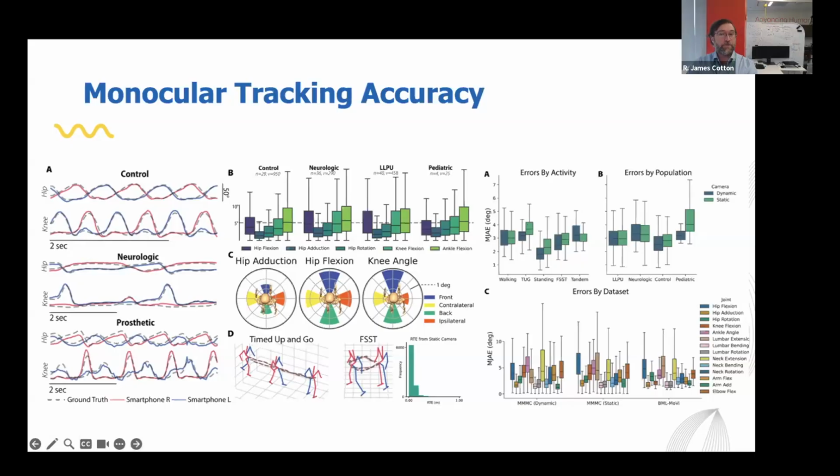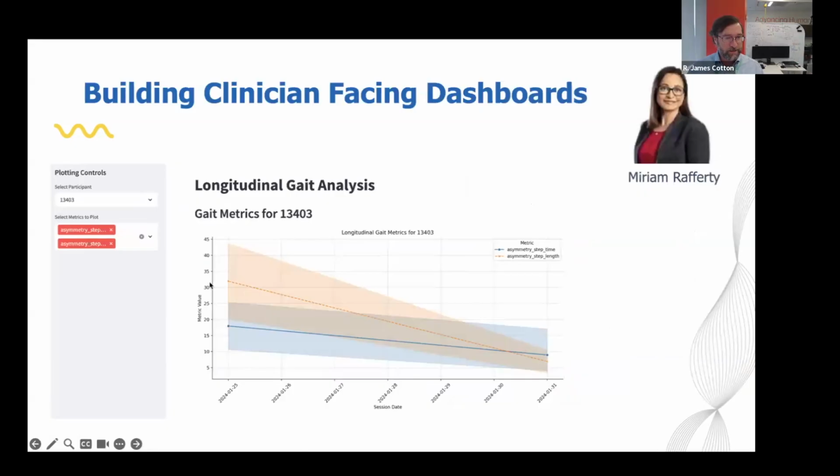Well, that's going to very much depend on the person, right? We haven't done population-level analyses, but maybe I'm not understanding the question right. Some people don't have much of an asymmetry, some people do. Going back to this, for example, we could see in this case this person improved, and they actually improved quite quickly. This is only 6 days, but their asymmetry reduced quite nicely from 20, or, shoot, I'm forgetting the metric I was using too. There's a slightly different version of the symmetry index that's well normalized between 0 and 100% that I used here.